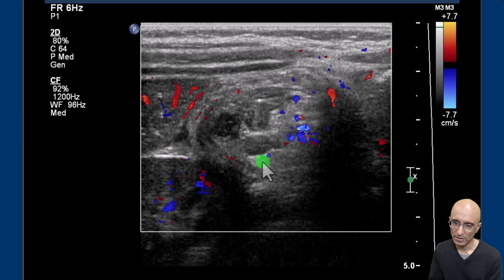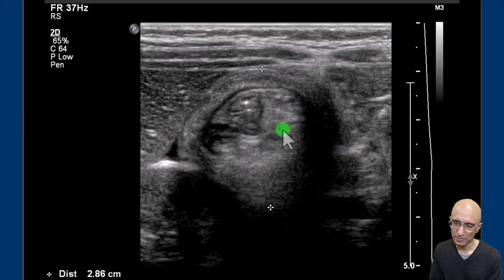On the color Doppler images, the vascularity was preserved within the soft tissue density lesion. Also notice the internal echogenic fat. This outer soft tissue density corresponds to the colon, and as we saw in the previous images, these two foci corresponded to the terminal ileum and the appendix.